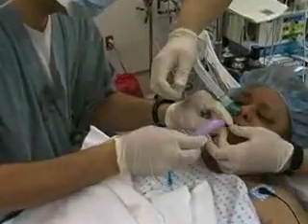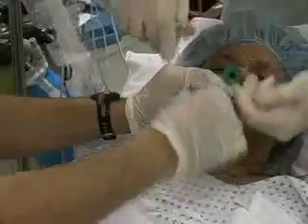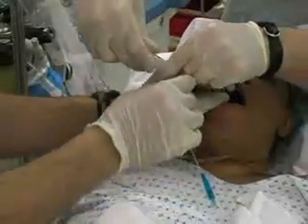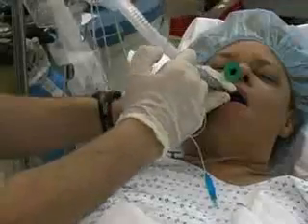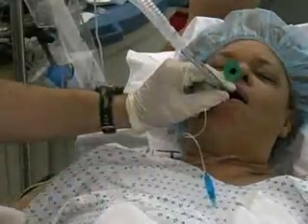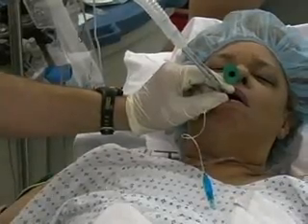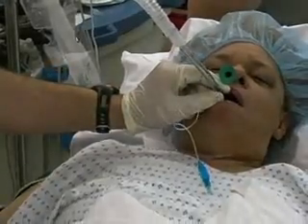Remove the Williams oral airway. Reattach the endotracheal connector to the tube, and attach the tube to the ventilator. With the airway secured, the patient may be induced at this time. Alternatively, the practitioner may choose to leave the patient awake while confirming tube placement.